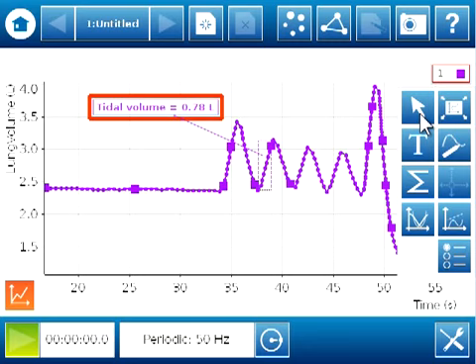graph. The 0.78 liters, that is the amount of air moved in and out of the lungs during normal breathing, is much less than a person's lung capacity. To determine another value called vital capacity, we'll need to analyze the change in volume when a person exhales forcefully after taking a deep breath.